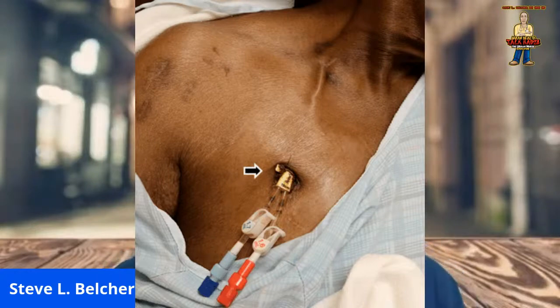Now, another sign that your catheter is not working well may be the pre-pump arterial pressure alarm. Very common when they say your arterial alarm is dropping. If you got a catheter, how many warriors had to be leaned back in the chair, what we call the Trendelenburg, or how many warriors had to cough? The technician or nurse told you to take a deep breath.